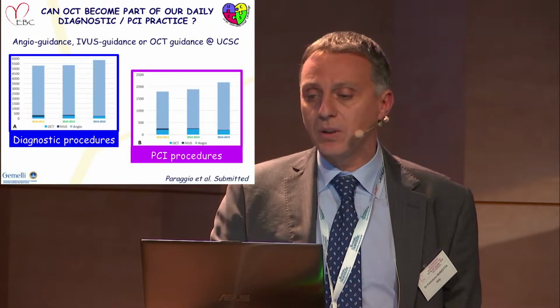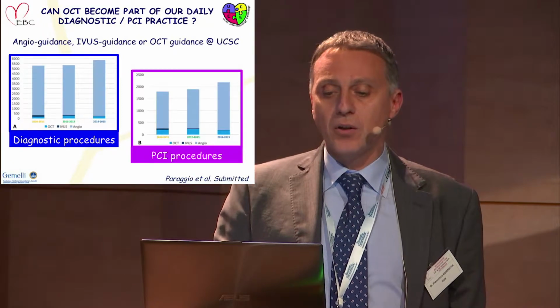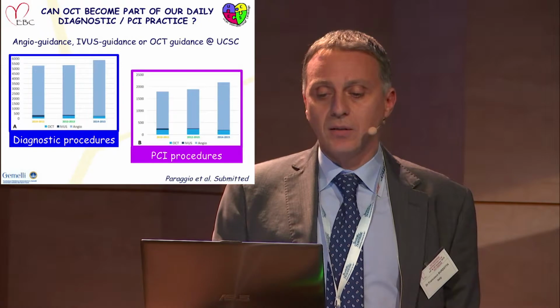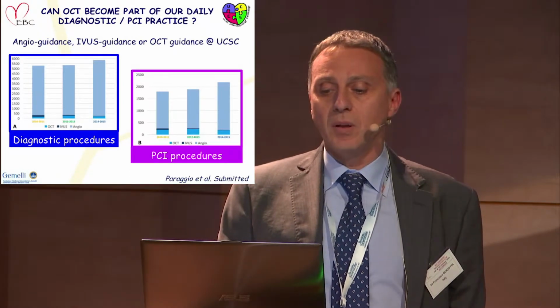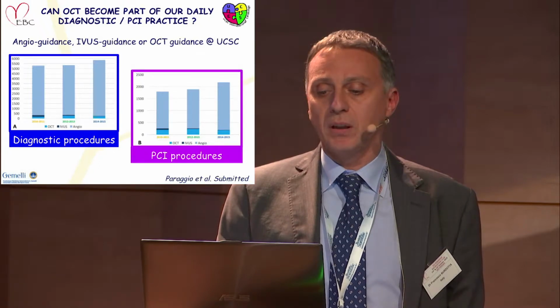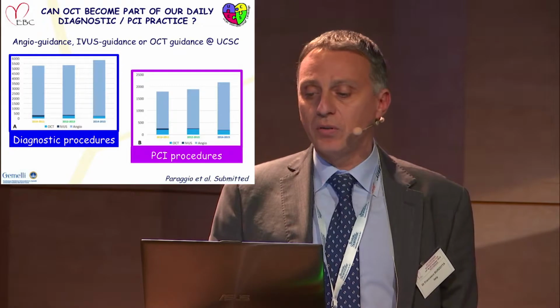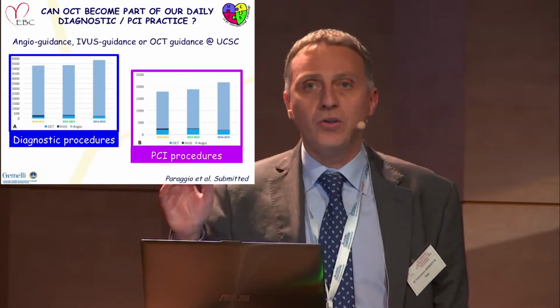on OCT some years ago, and this is the performance of angio guidance, IVUS guidance, and OCT guidance during these years, starting from 2010. What you see, the blue bar, which is IVUS, for both diagnostic procedures and PCI procedures, is almost abolished and just reserved for ostial lesion.